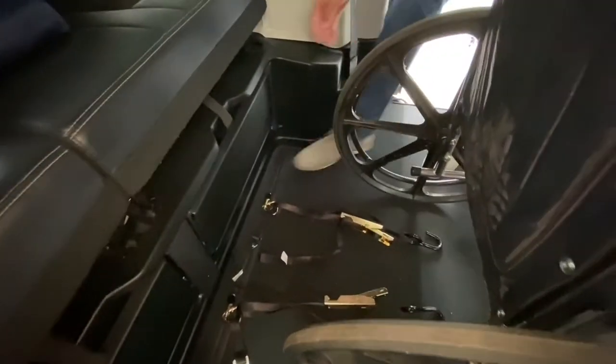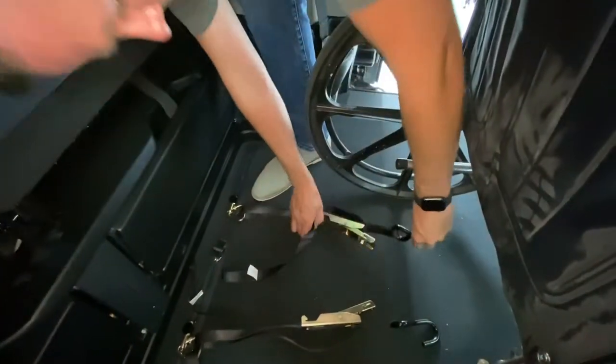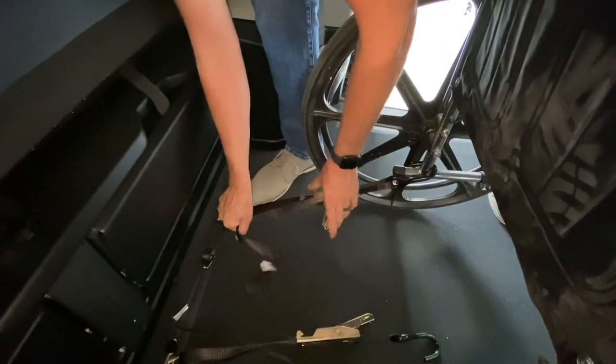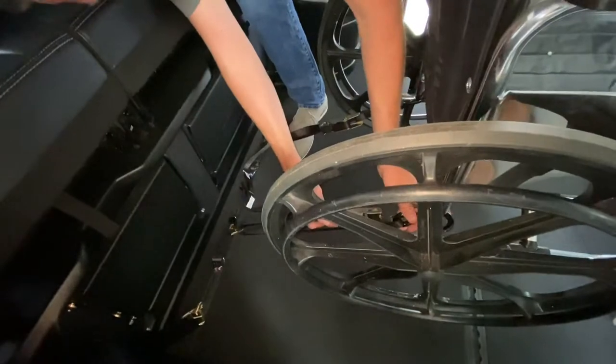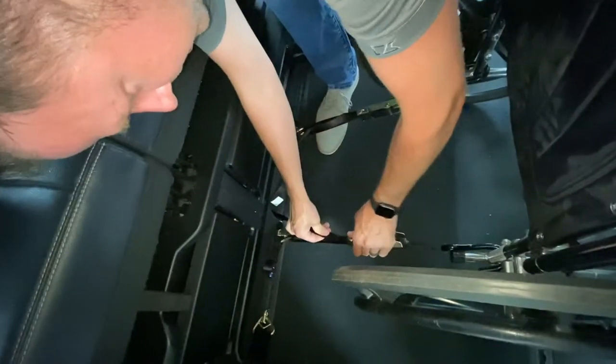You will need two in the front and two in the back, shown here in the video. Most power chairs will have d-rings, and most manual chairs you will use the frame to tie down to. Please contact your local mobility consultant to see how to properly tie down your wheelchair or power chair in your van.